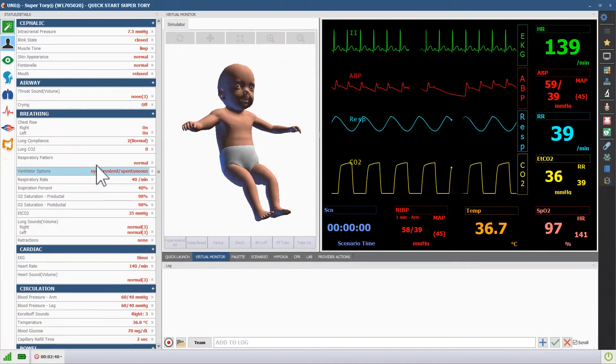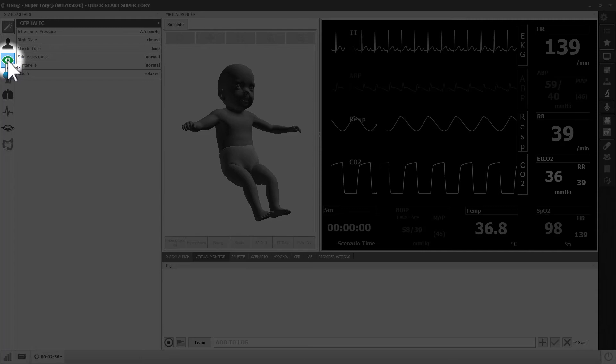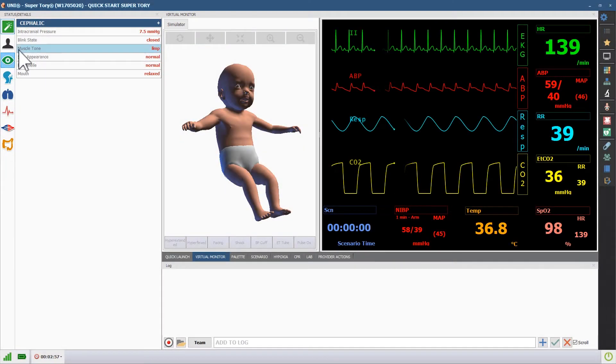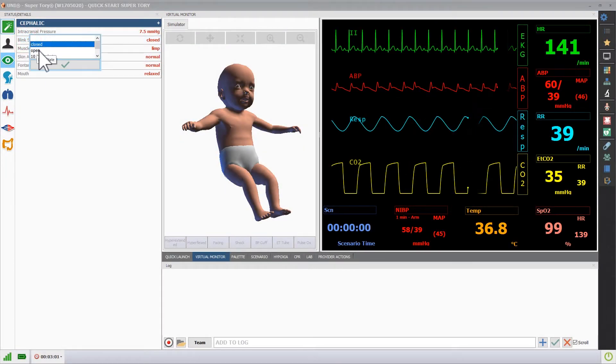To change the activity of Supertory's eyes, open the cephalic menu. Click the blink state vital and choose the desired change.